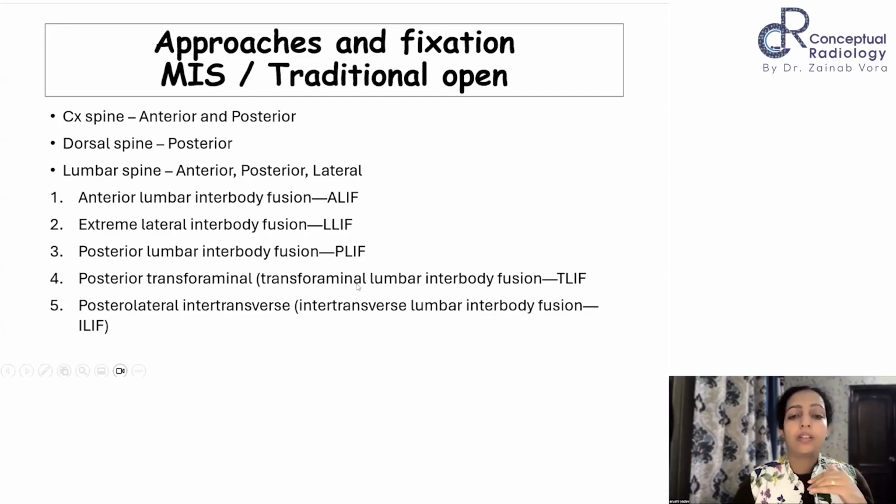The idea or the aim behind all of these approaches is to go and cause the fusion. Put your hardware in and cause the fixation. So fixation along with the hardware is your entire idea, and to remove what you want to remove, if it is a disc, if it is a facet, if it is a lamina.